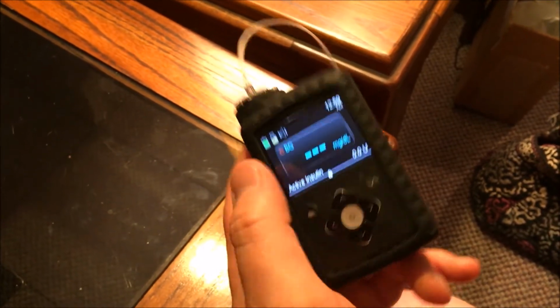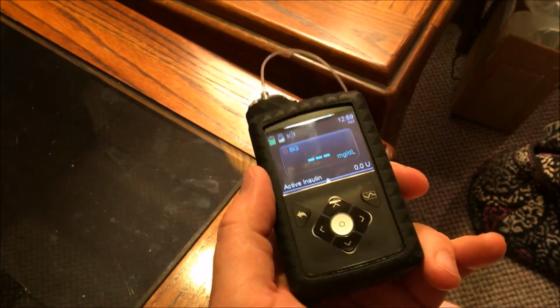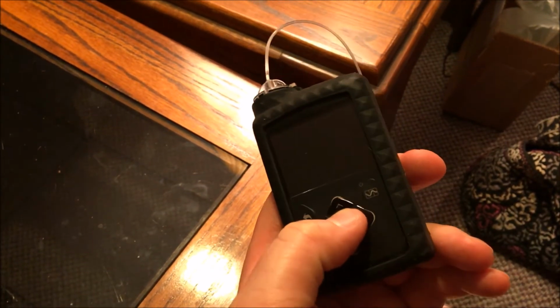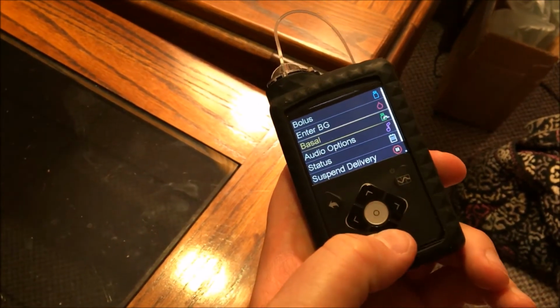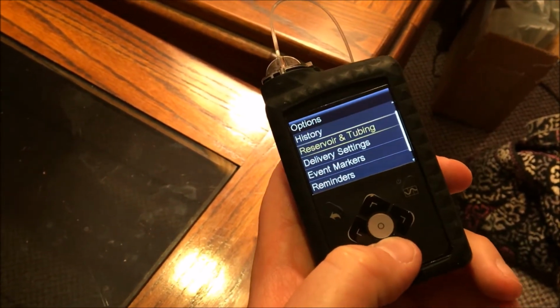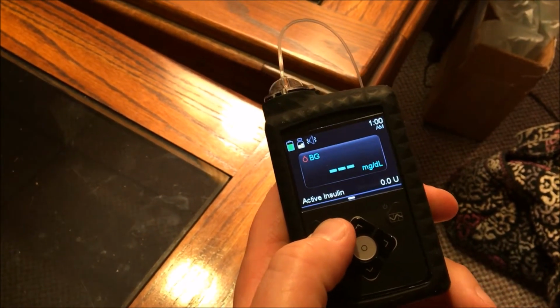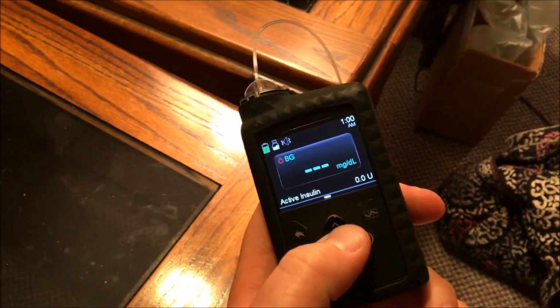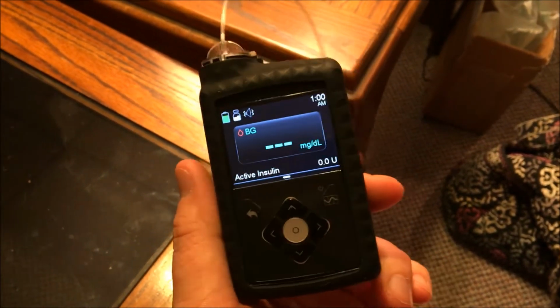As far as the tones on it, the tones are much clearer on this one. I could hear them much more clearly. They're louder. So that is a really awesome thing as well. The menus are mainly pretty clear. They work pretty well. There's a couple times in the menus where you're hunting for things and they're in places where you wouldn't guess, like in options. There's quite a bit here. Reservoir and tubing and all that is in options, and in the old pump I think you just went to it. So there's a couple extra presses and some things are a little bit harder to find. Once you know where they're at, it's no problem.